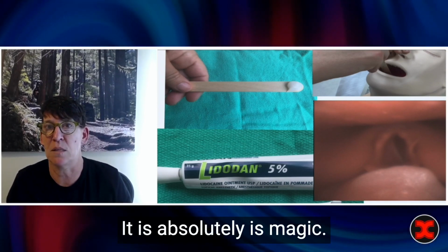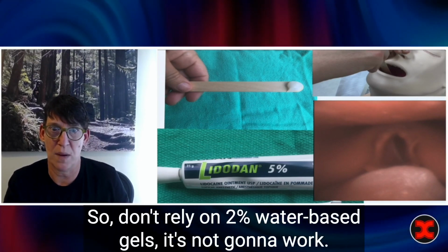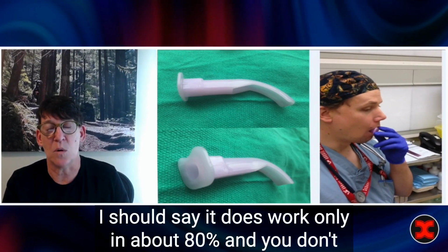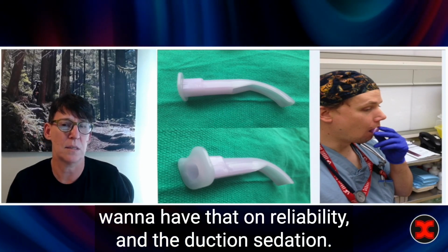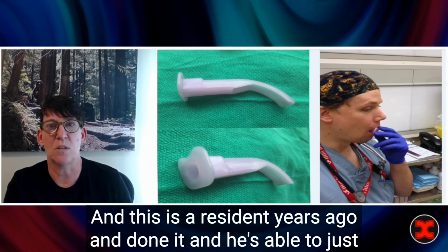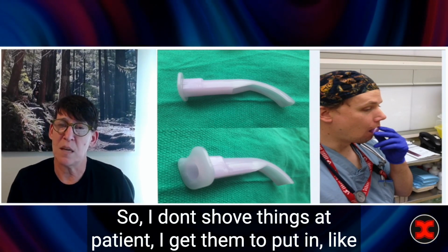It absolutely is magic. So don't rely on 2% water-based gel. It's not going to work. I should say it does work only in about 80%, and you don't want to have that unreliability in the transition from awake to sedation. And this is a resident of mine years ago, and he's able to just easily put in his own oral airway.